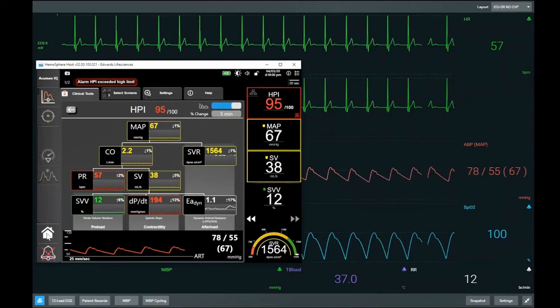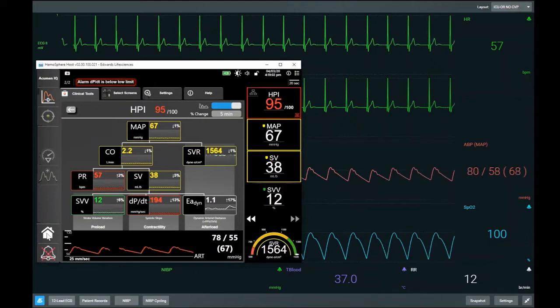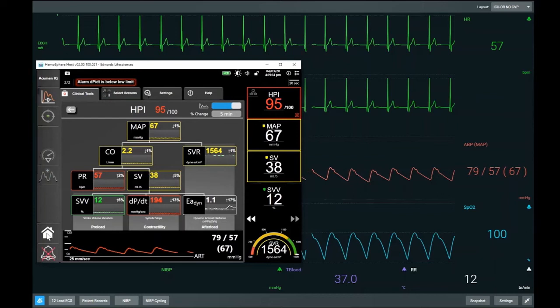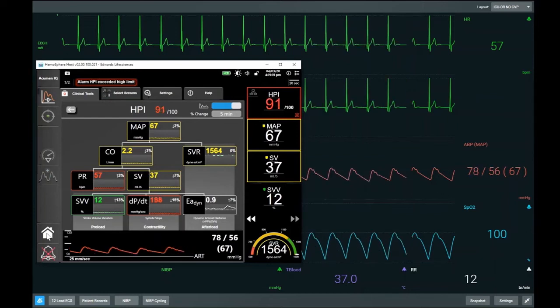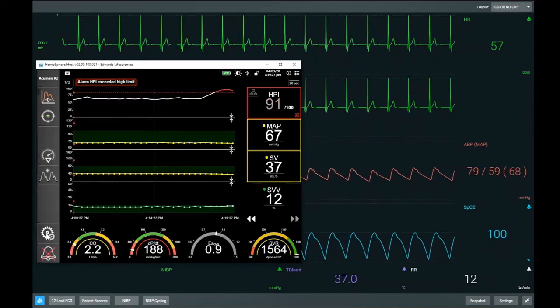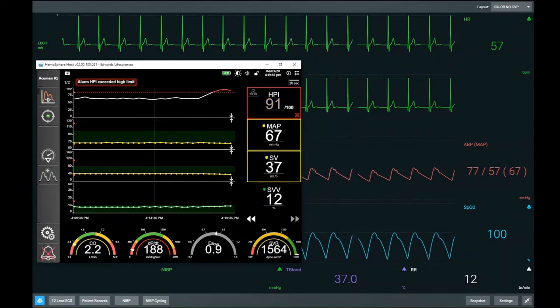Our MAP is 67, so we're not hypotensive yet — remember the definition is less than 65 for more than one minute. Cardiac output is a bit on the low side but has been stable for this patient. Systemic vascular resistance is within relatively normal ranges. Pulse rate is reasonable. Stroke volume is a bit low, but we have a poor ejection fraction and known ischemic heart disease, and we are not a preload responder — SVV is just 12. Our DPDT is starting to drop: the pre-induction baseline was 250, earlier in the scenario it was 220, and we are seeing a further decrease.